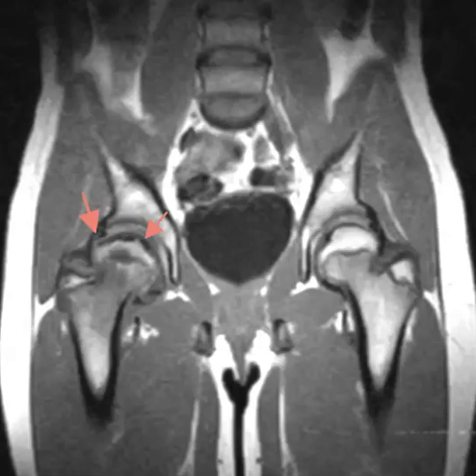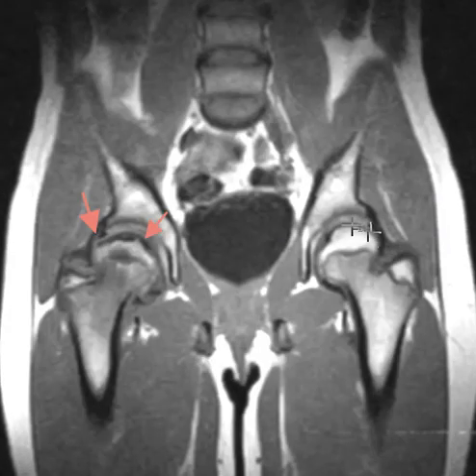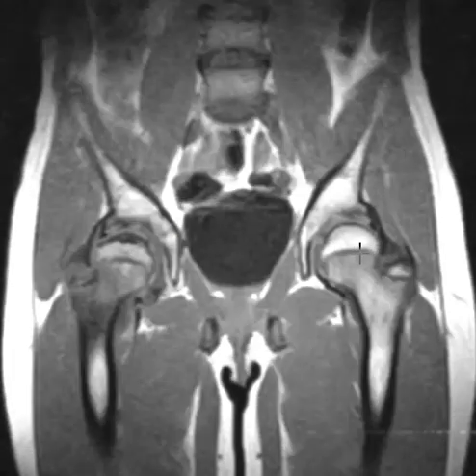Hello, this is Dr. Gay from First Sec MRI, and this is a 15-year-old female gymnast with complaints of right hip pain. On this large field of view image, we can see both hips. We see the left femoral head. This round ball looks great. We see the growth plate here, not fused yet, looks normal.